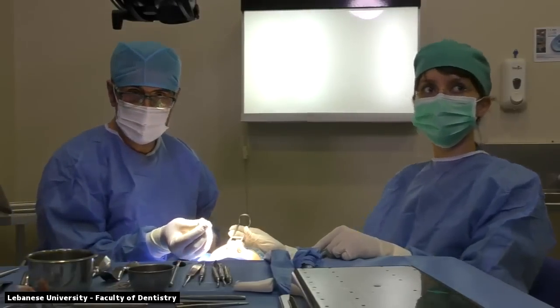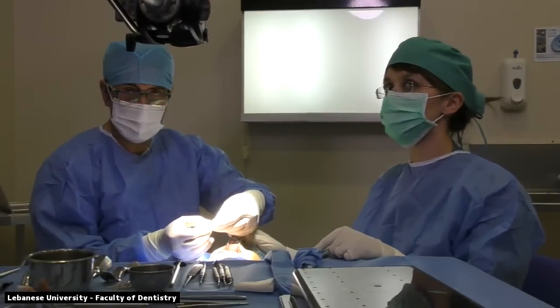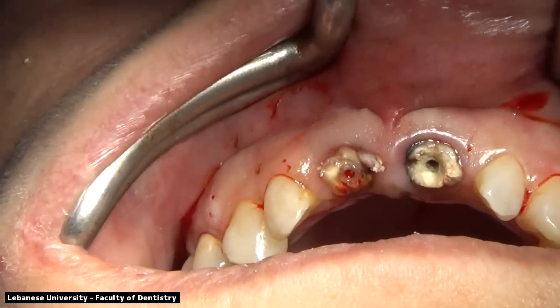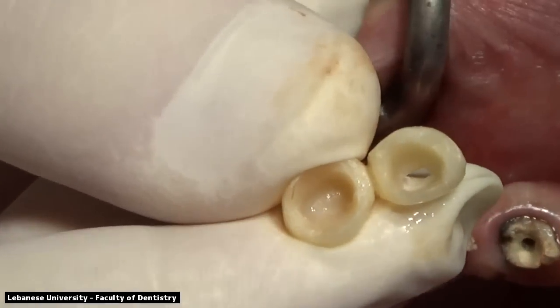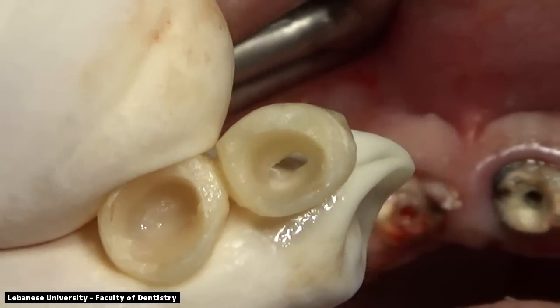Those new temporary restorations were already pre-prepared, and we opened them from the inside so that we can add acrylic material in the end and reline them. They were prepared before the surgery to make the restorative phase after the surgery very quick and easier for the patient. So this will be used for relining at the end of the surgery.